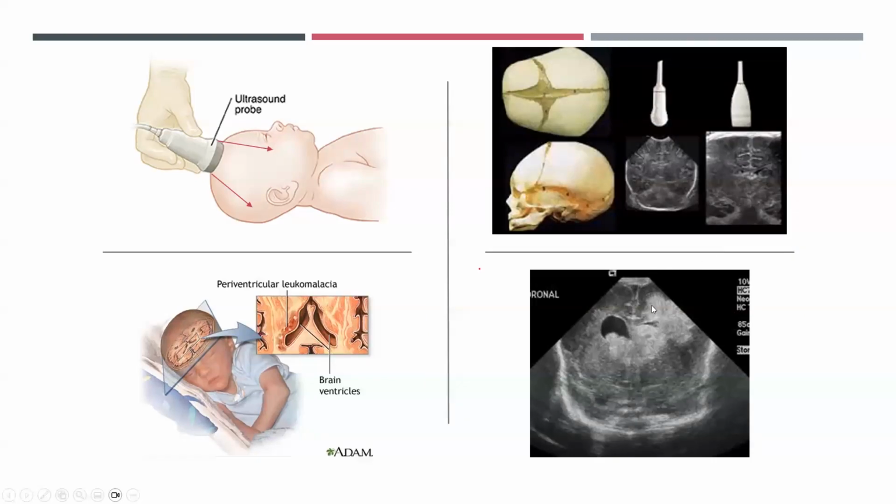But a good example that I'd like to give you is a baby who's got a grade 4 IVH. If you're using a probe with a certain frequency and there's no IVH, sound waves will penetrate through the fontanelle. They'll interact with the tissue. Naturally, because they interact with the dura and the pia first, there's a lot of reflection, which gives you a bright image, and then they become a little bit attenuated, so you get a slightly darker image. But the sulcal gyral appearance, there's a lot of scattering. Because of scattering, you tend to get the sulcal gyral appearance.